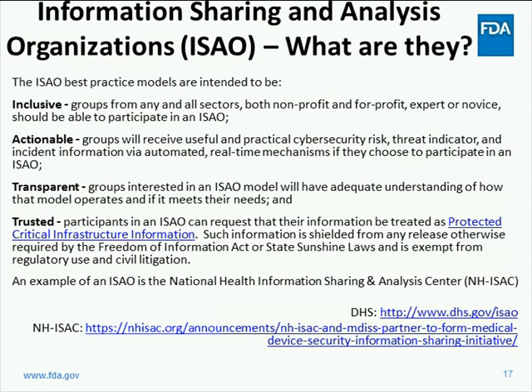Now we're going to turn to a key concept in the final guidance regarding information sharing and analysis organizations, or ISAOs, which I'll discuss briefly. We have the benefit of having Denise Anderson from the NH-ISAC and Dr. Dale Nordenberg from MDIS, who will be speaking to these concepts specifically.